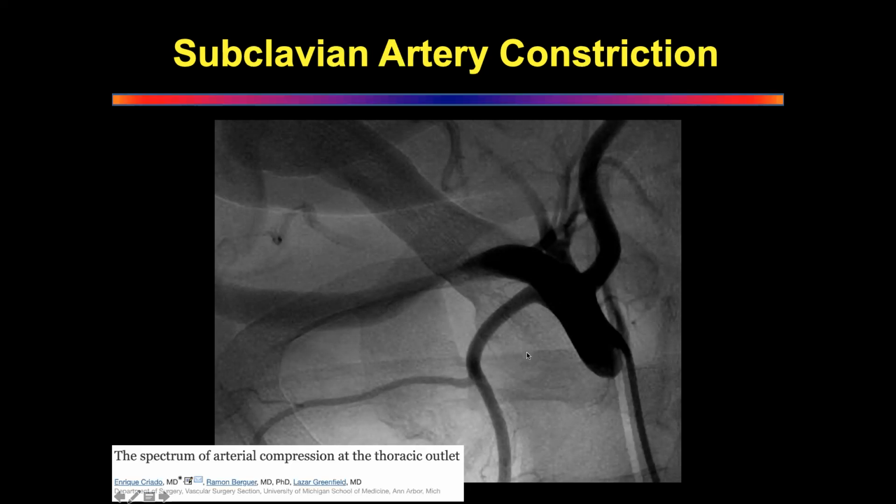Okay. So what can you see here? So there is a filling of the dye, but after the three vessels, there is a gradual abrupt cutting. Narrowing of the dye. And what is happening here? And then again, there is a free flow of the dye. It's not free flow because this is free flow. Look at the color of the black. Black is free flow. This is not free flow. So there is obstruction and there is reduced filling distal to the obstruction.